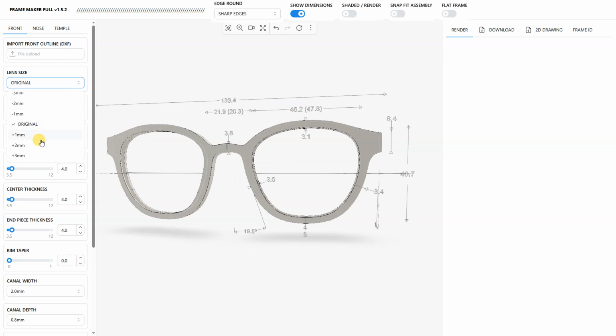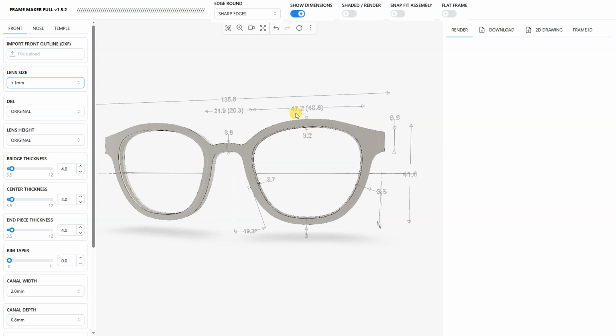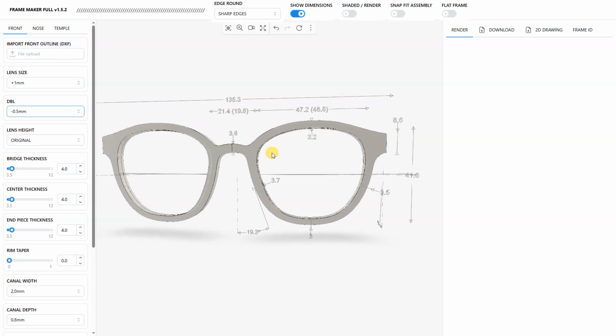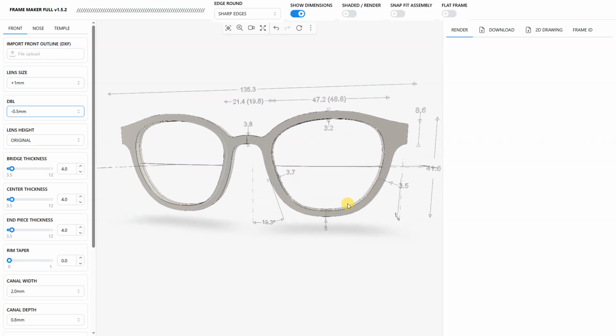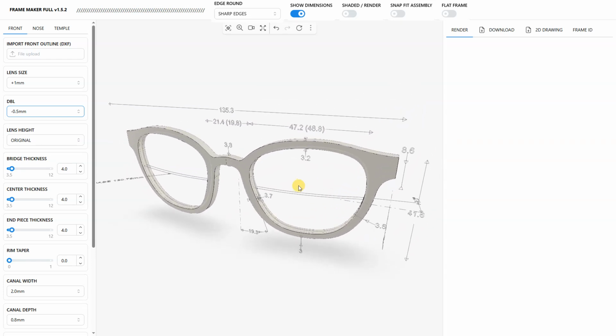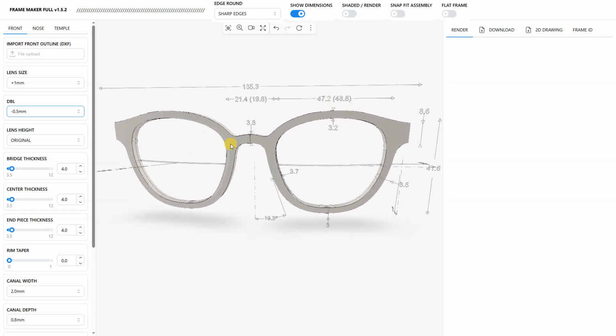If I want to add, let's say, 1 millimeter to that 46, it's going to be 47.2, obviously, and let's wait for it. There it is. And let's see the DBL. I'm going to remove 0.5. There it is. That was quick. And between brackets, we have the measurements considering the lens canal. So the lens groove in this case has a depth of 0.8. So that's 1.6 for each side. And that's what you get between brackets.